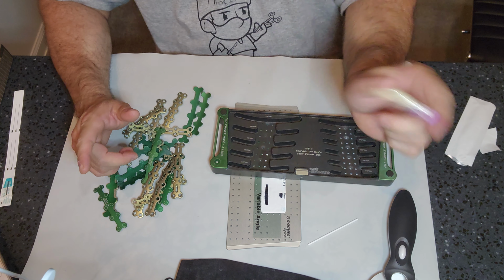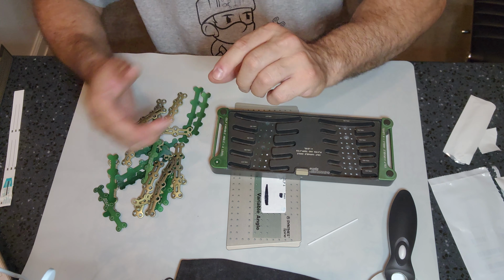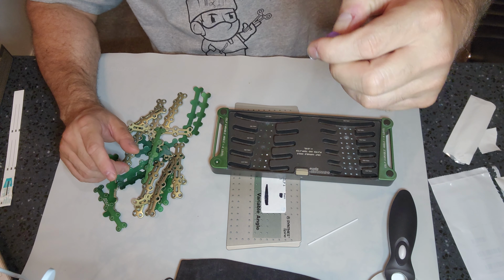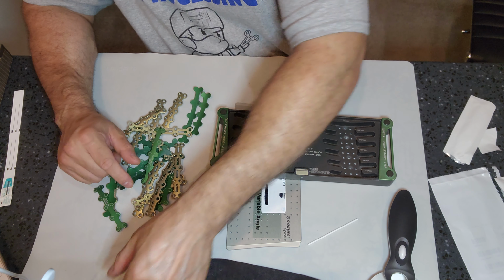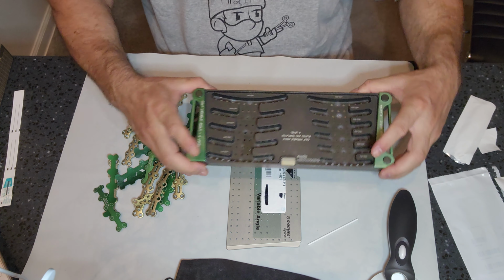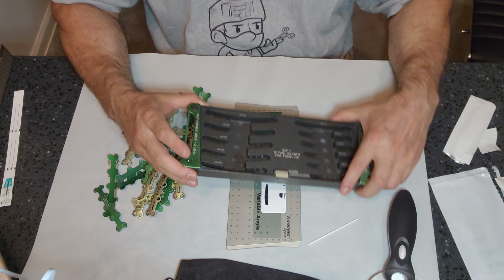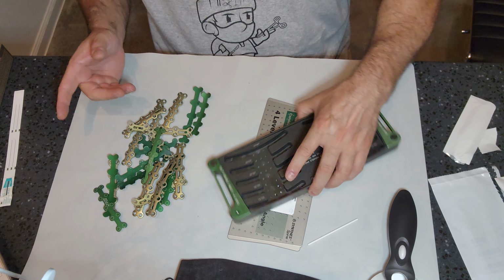Or whatever the IFU states. I'm not sure what the IFU states on this one. I don't have it with me at the time. Okay, and this gives you a reading in 5 seconds or so, but it's stated to leave it there for about 5 minutes. Okay, this is going to tell you if it's protein or not. But that tray has a foreign body on it. Okay, there is a soil on there that I do not recognize. That's not part of the tray. So this tray should go back to decon.